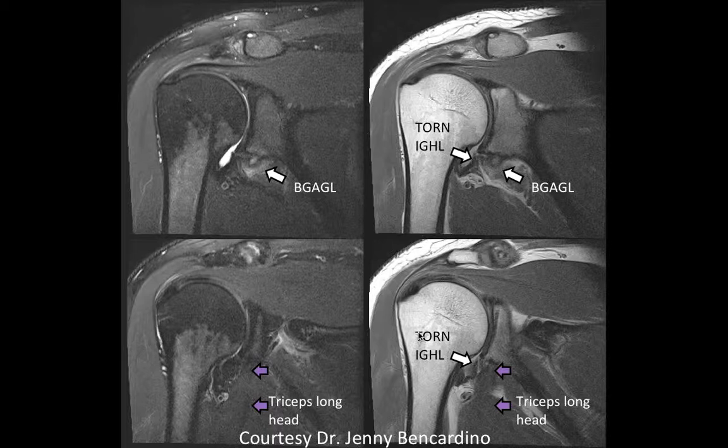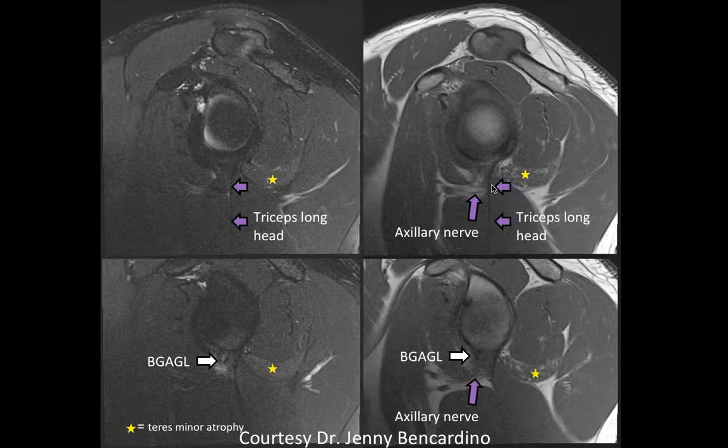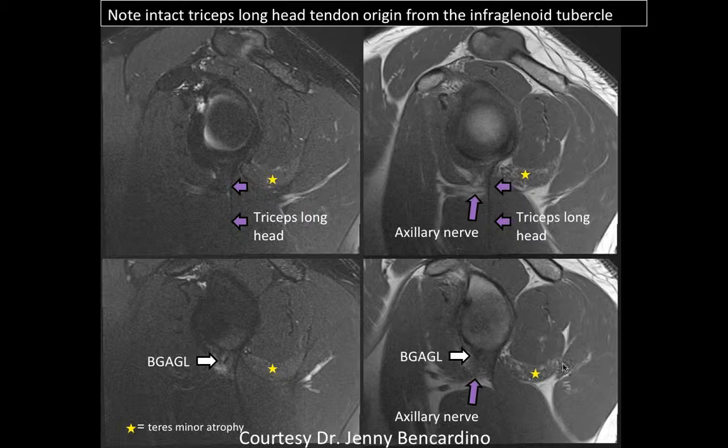Okay, Yuri, what do you think of this case? So, a 39-year-old underhand ball player with right shoulder pain, worsened with overhead motion following trauma during a match 1 year ago. There's abnormal bone density seen within the inferior glenoid rim, which is suspicious for an inferior dislocation on advanced imaging.